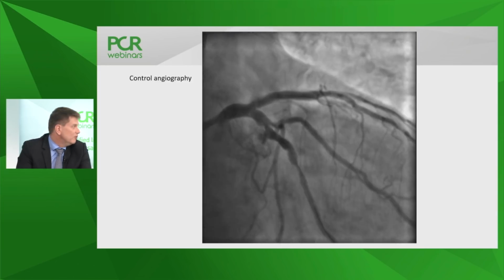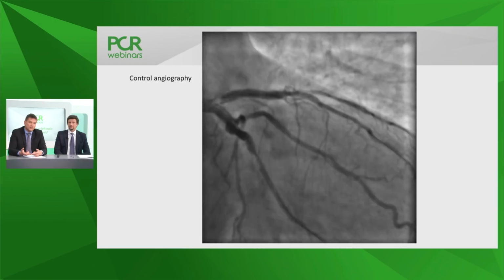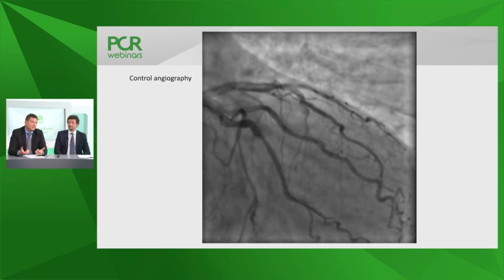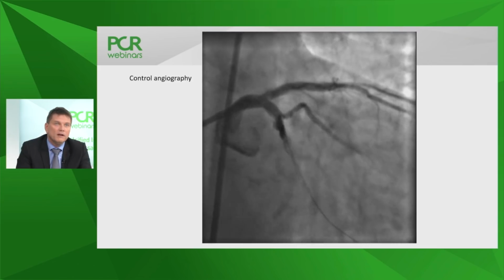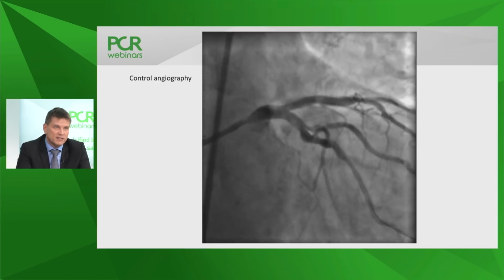Either you take a bigger balloon, well, bigger than 4.0 I wouldn't take on this proximal LAD, definitely not. And the next is you can take higher pressures. But what should be the reasoning? I mean, you have a 4.0 balloon fully opening up. So honestly, I would be done at this point.